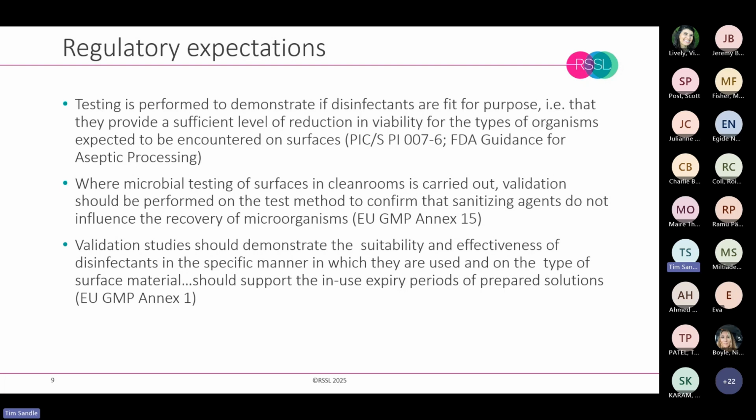And we need to account for the manner in which we're going to use these disinfectants. So again, there's no point having a theoretical assumption in a test tube if that quantity is not then available on a mop head. And also the types of surface materials, because we can get a wide range of different outcomes for different surfaces.